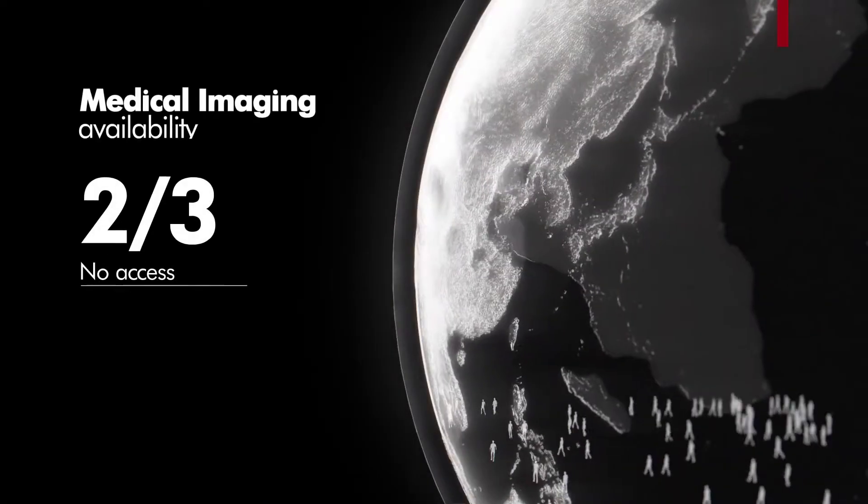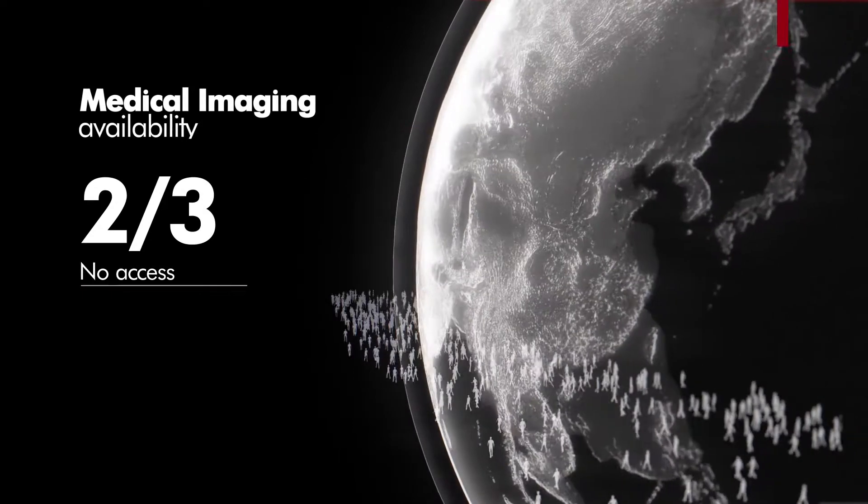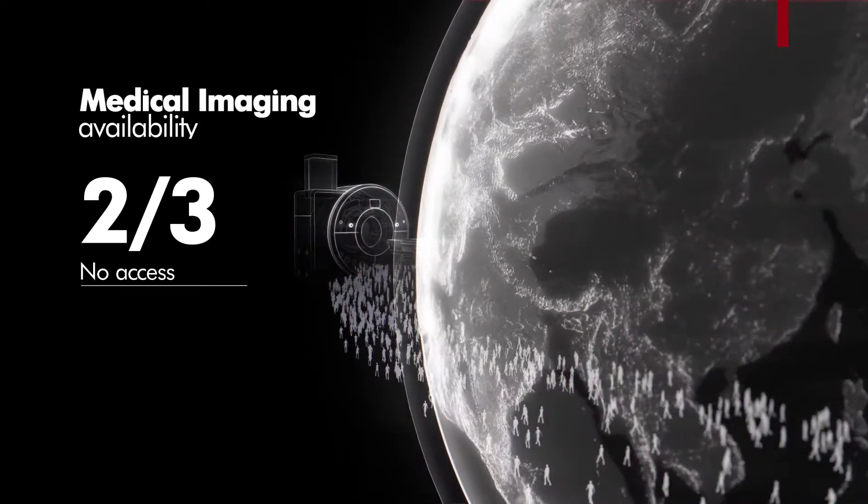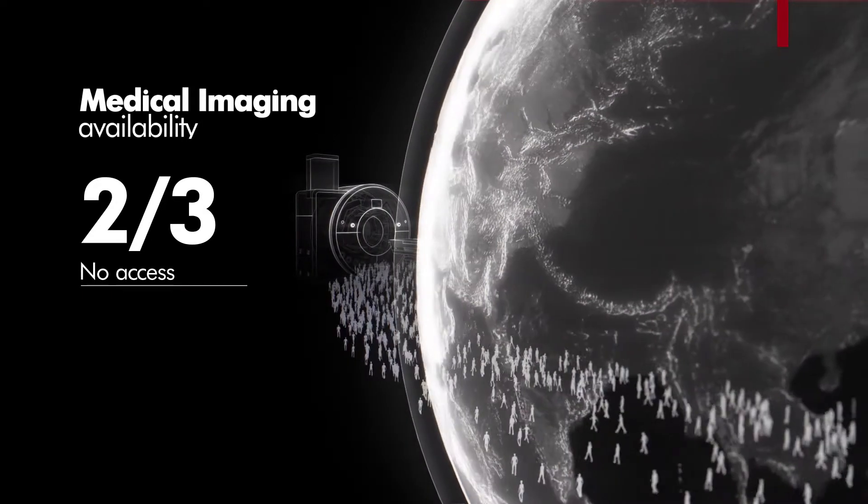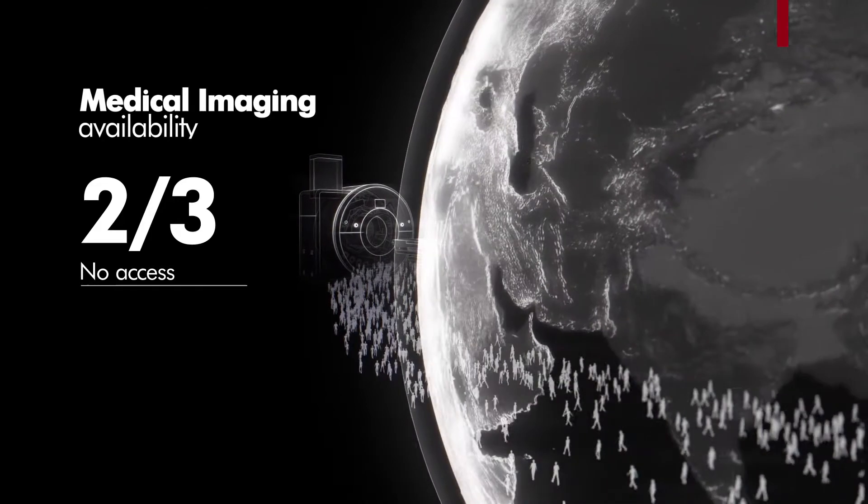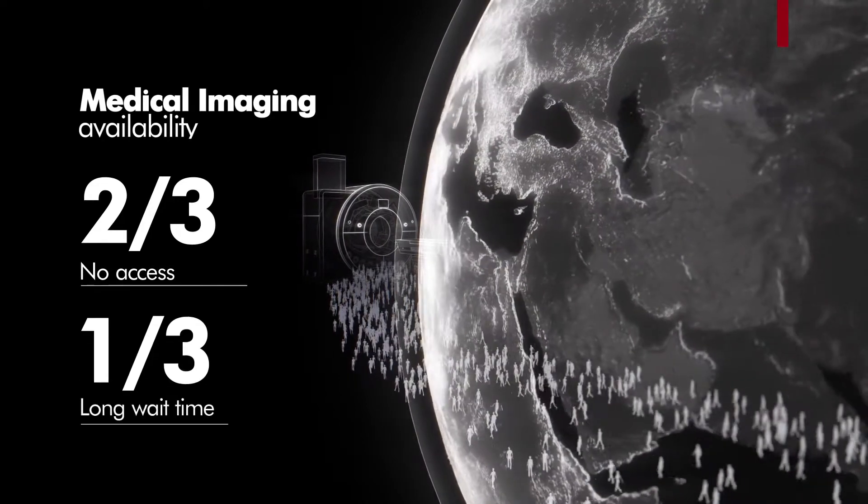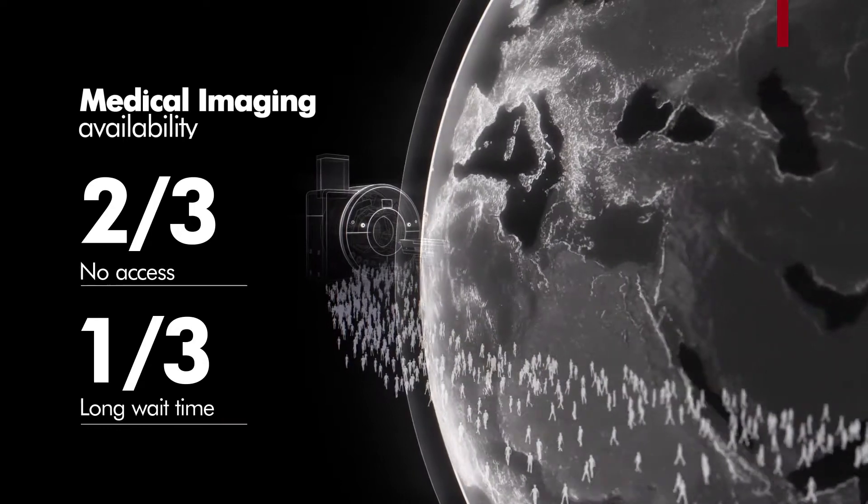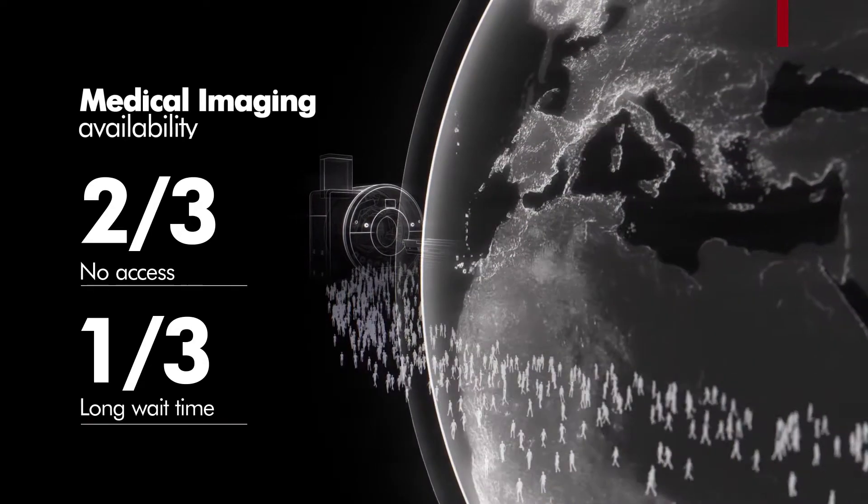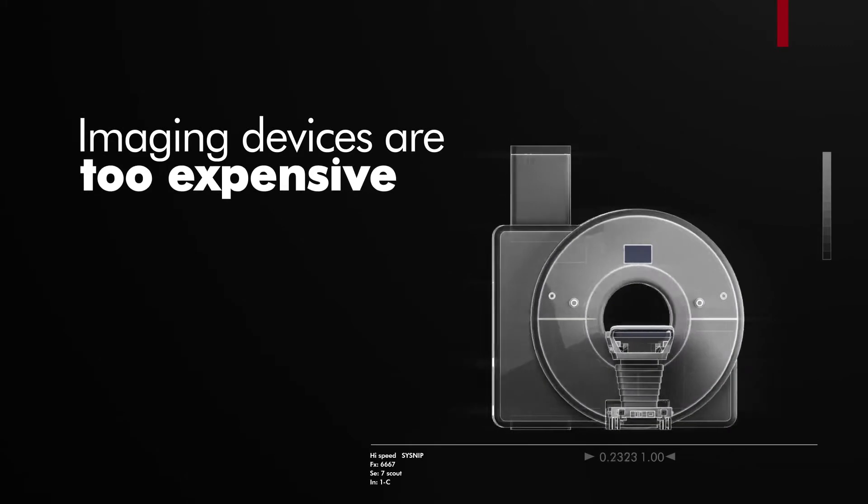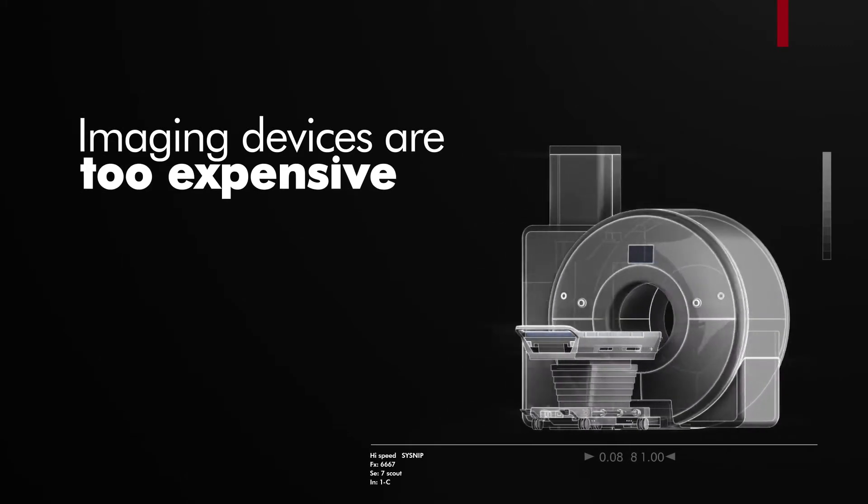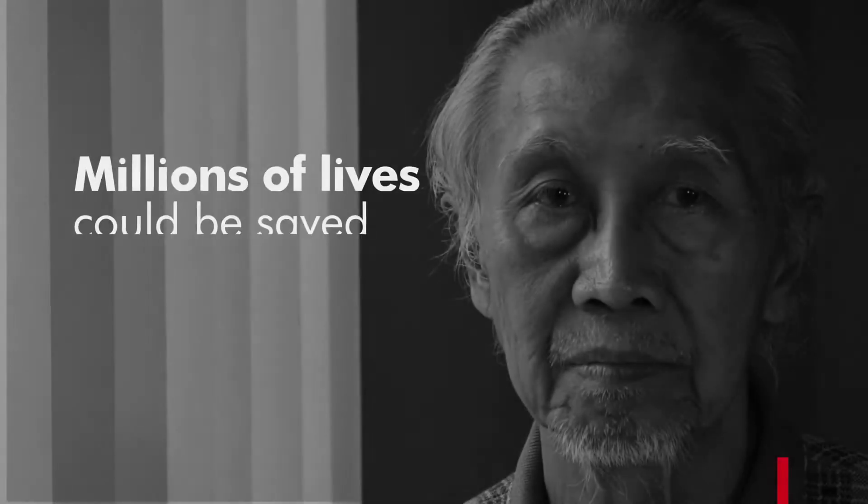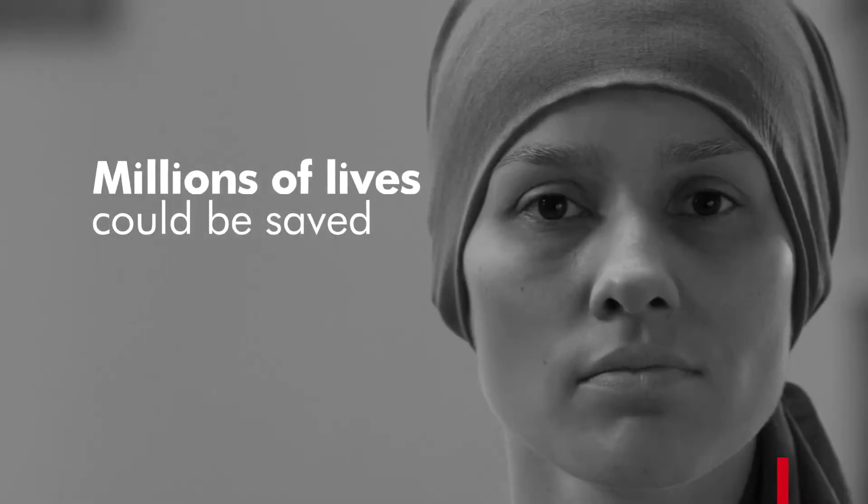Two-thirds of the world's population has no access at all to medical imaging such as CT and MRI scans. The remaining one-third needs to wait weeks and months for a scan appointment and for test results. Imaging devices are simply too expensive and cannot be deployed in mass.